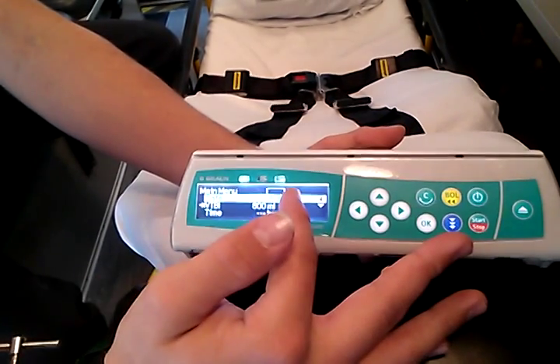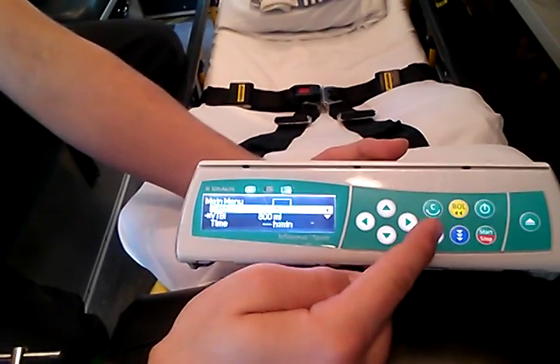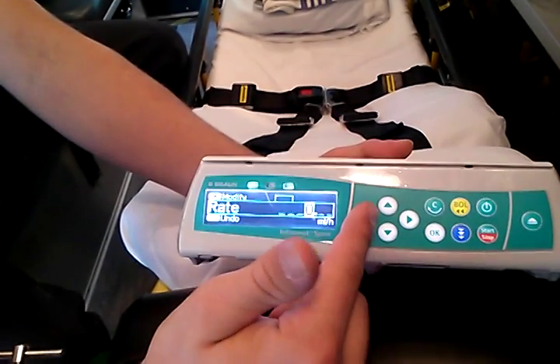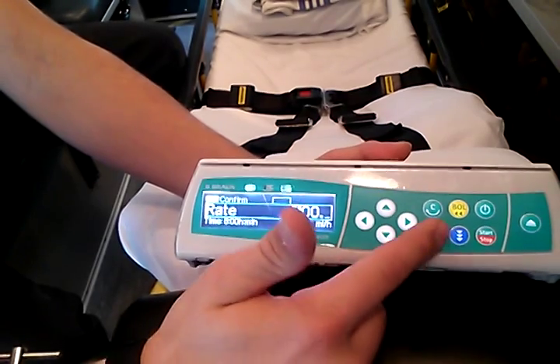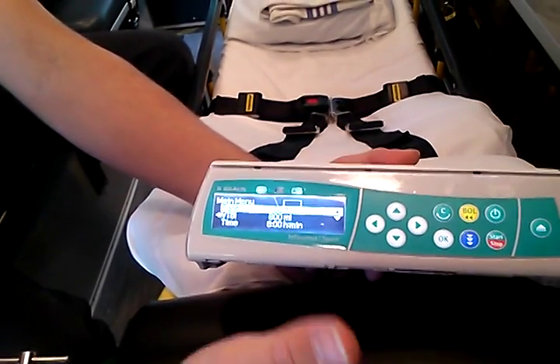Usually you're going to know the rate — it should tell you on the pump the patient's already on. Let's say they're going at a rate of 100 mLs an hour. We know the rate, so we'll hit OK and set the rate to 100 mLs an hour, and hit OK. That's it — now your pump is set up and ready to go.